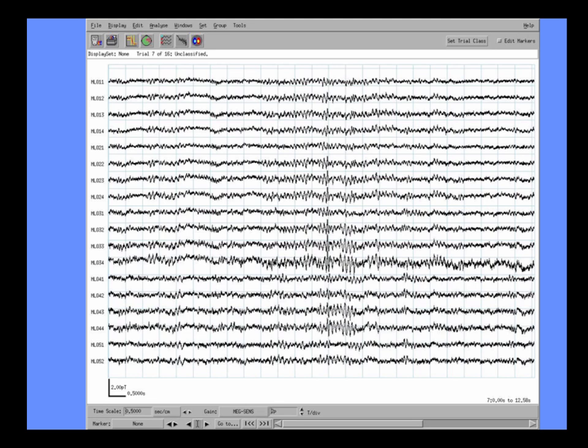The signal itself looks exactly like EEG. People here may be not aged enough to remember the days of polygraphs, where you had a paper tracing with ink pens scribbling out the EEG trace as it goes by on paper. But this is exactly what it would look like, or on a computer screen.